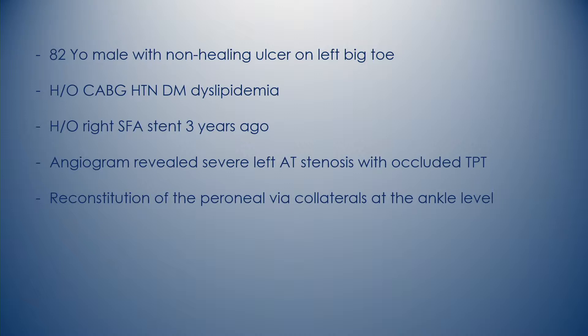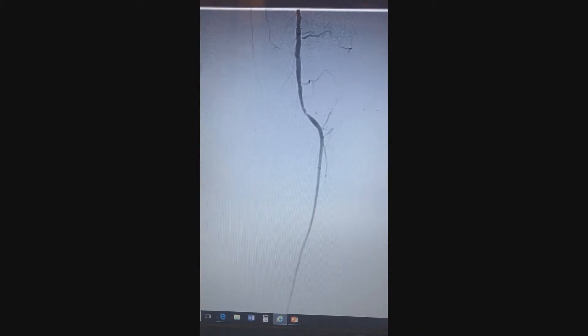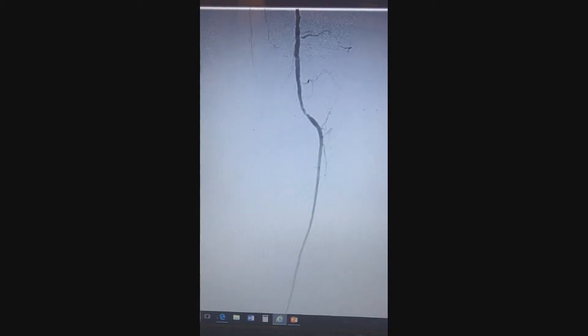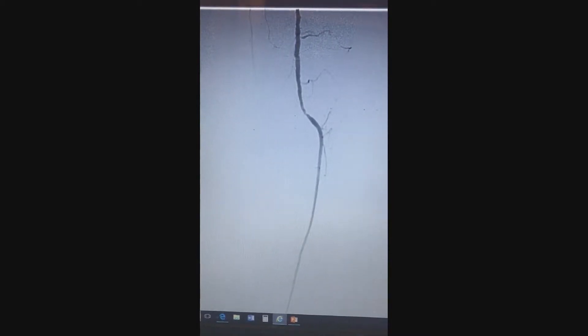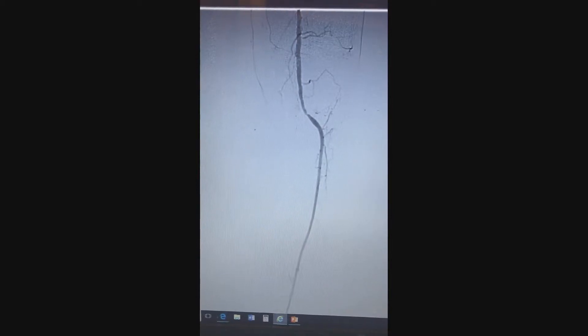An angiogram was planned. This was a right femoral access with a crossover to the left femoral. The iliac and the common femoral SFA had just mild disease. In the infrapopliteal segment, as we can see, there's severe stenosis in the anterior tibial and occlusion of the tibial peroneal trunk.